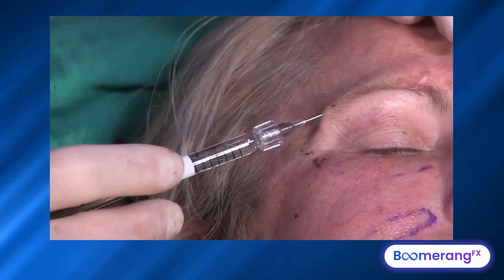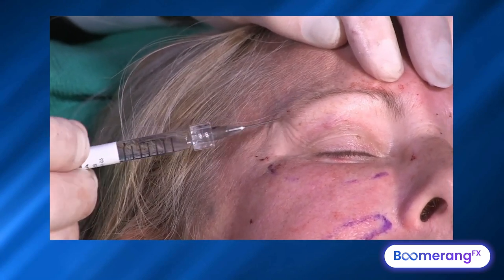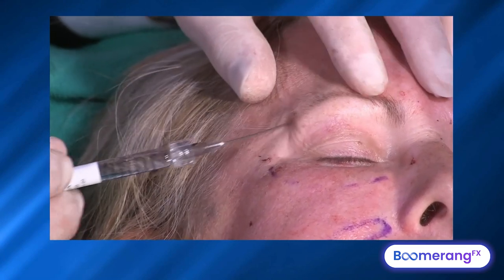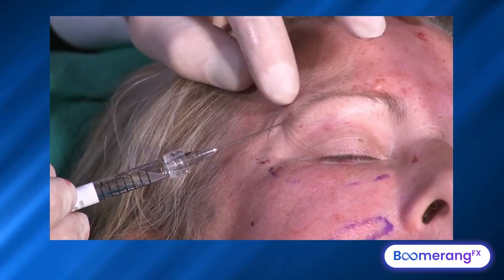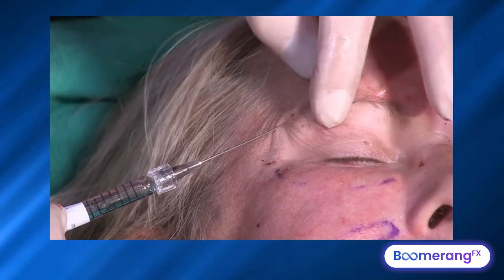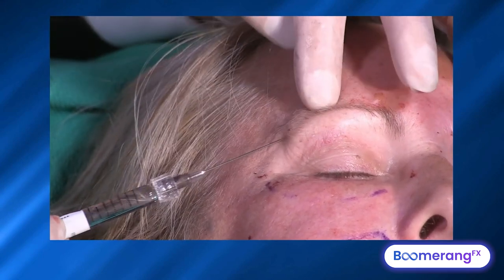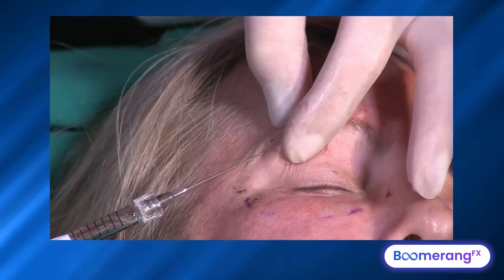I advance and then inject retrograde — advance, inject on the way back. Slow, retrograde, low-pressure injections. As I get to the last third of the brow, that's where I want most of my shape. I'm staying just above the hair to get a nice light reflex and give a mechanical lift effect.